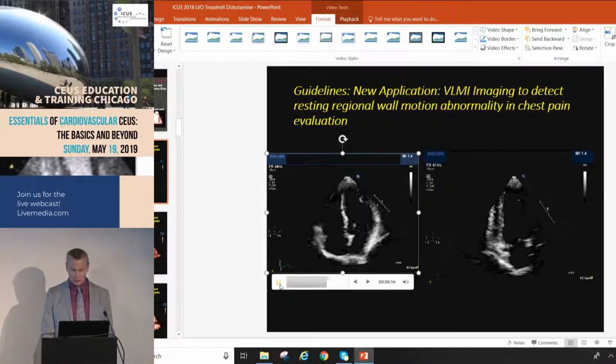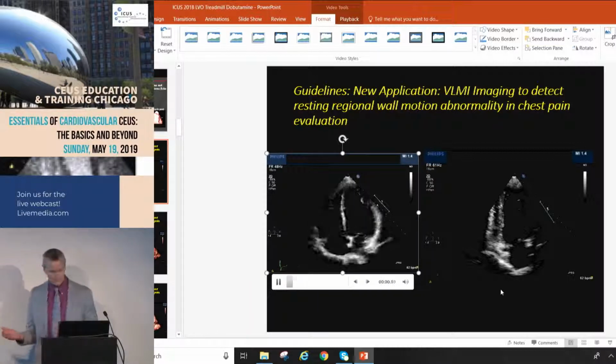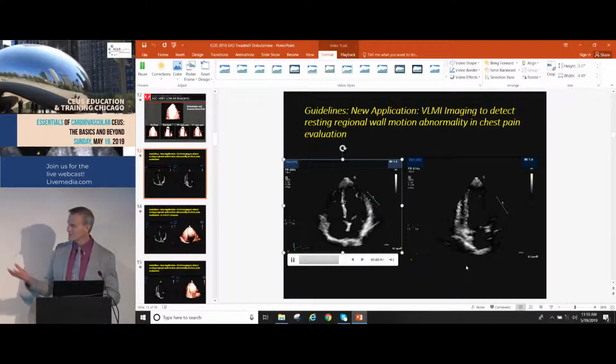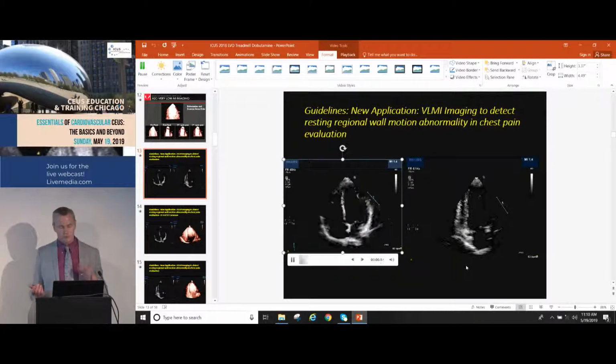Okay, so what do you guys think of regional wall motion there? And do we think we need contrast at all for this kind of case? Okay, the anterolateral wall may be a little bit poor, but you're trying to be nice to us and say, well, yes, I would use contrast, right? But if you were really seeing this patient, this is a patient that had some methamphetamine use in the past, having chest pain. Trop was 0.11. Trop was a little elevated.